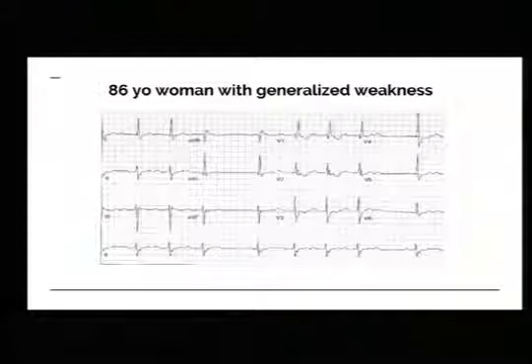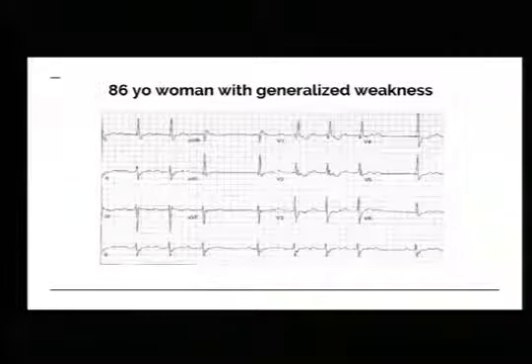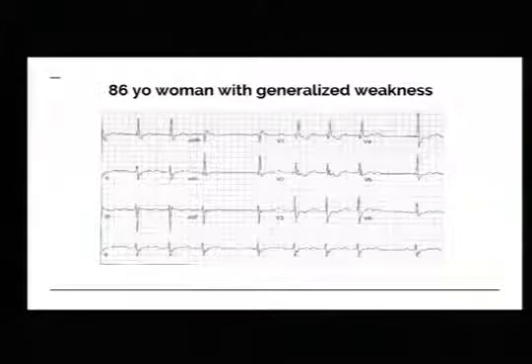And it's best if you look at, obviously, your rhythm strip at the bottom here. So P, QRS, P, QRS, P, QRS. So what is that? Anybody? So short, a little bit longer, a little bit longer, a little bit longer, drop. Anybody? Yes. So, Mobitz 1.